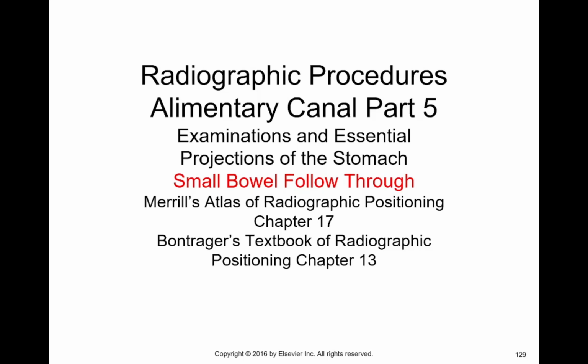In this recording, I want to talk about the small bowel. We often refer to the study of the small bowel with contrast as small bowel follow-through. It often follows an upper GI, so sometimes you will have an esophagram, upper GI, and small bowel follow-through all in the same exam on the same patient.